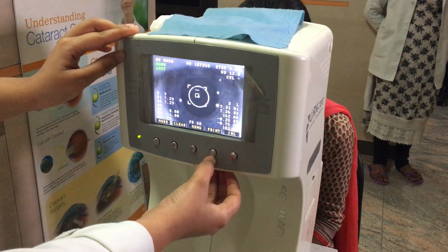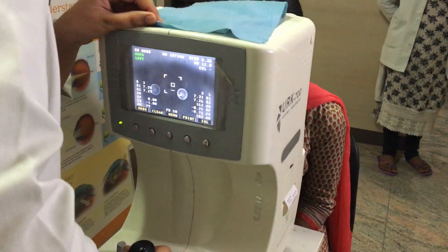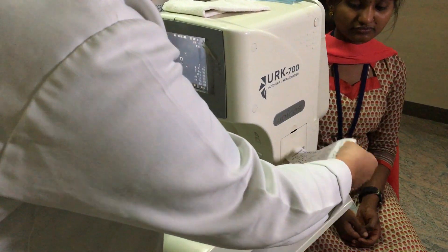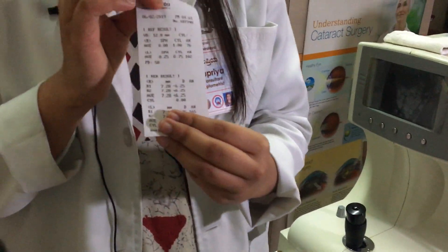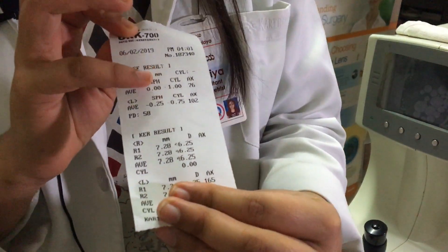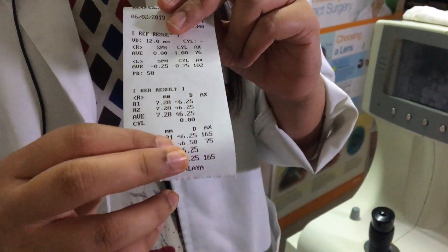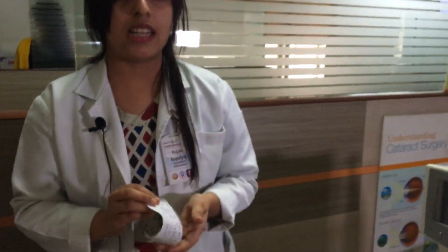We are going to select our paper and the earlier power reading. This is called the keratometer plus auto-refractometer reading. This shows refraction values and this is the keratometer reading. Based on these refraction values, we proceed.